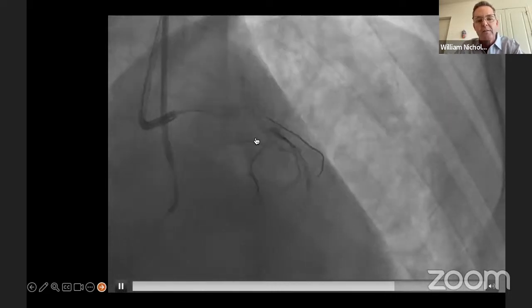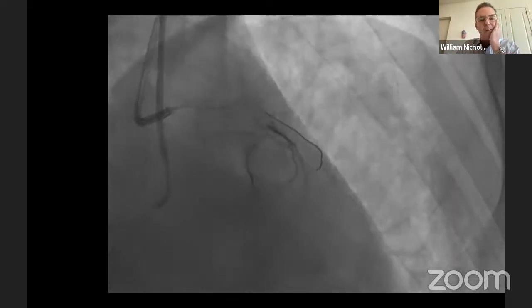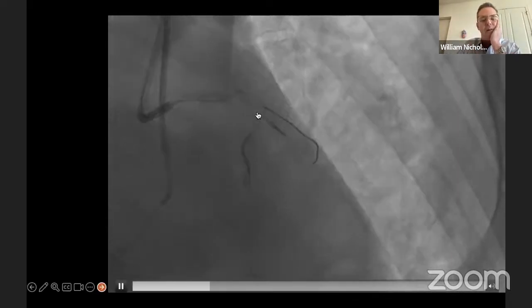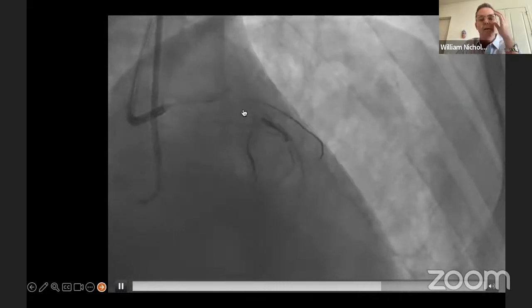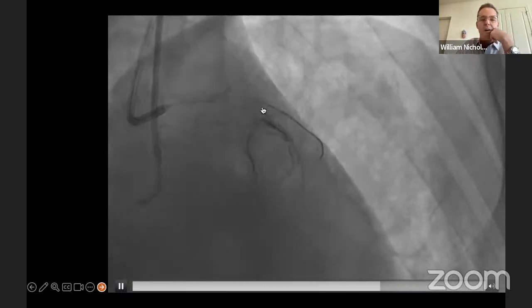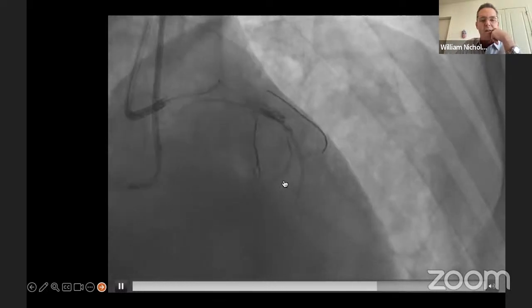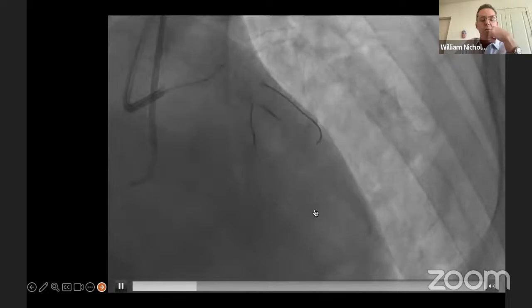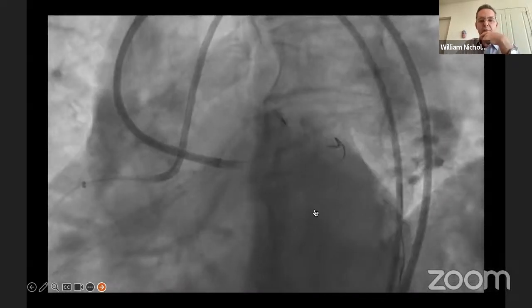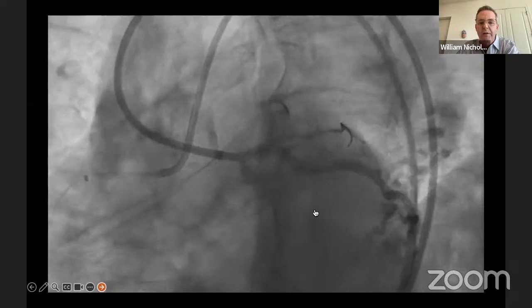And so this is a scenario that, as you described, is really unfavorable to do ADR, because if we do ADR or retrograde reverse CART in this occluded segment, somewhere in there the side branch is coming off, and so our access to that is going to be greatly inhibited.